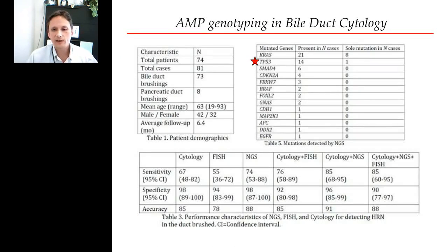SNV applications, I'm not going to talk about the general applications all of you know about, EGFR testing, BRAF testing. I'm not going to go into those kind of details, which I assume everyone is well aware of. But some of the new applications we're looking at that I'm most excited about are in cytologic samples. Many of you probably know about Yuri Nikoforov's work in thyroid from the University of Pittsburgh, done some great work. I think following on that, we were excited to apply NGS, and we've applied our solid tumor panel to several cytologic samples, including pancreatic cysts, which is basically standard of care at MGH, that all pancreatic cyst fluids get sent for NGS.